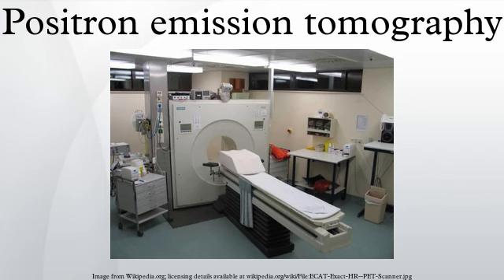As a result, FDG-PET can be used for diagnosis, staging, and monitoring treatment of cancers, particularly in Hodgkin's lymphoma, non-Hodgkin lymphoma, and lung cancer. Many other types of solid tumors will be found to be very highly labeled on a case-by-case basis, a fact that becomes especially useful in searching for tumor metastasis, or for recurrence after a known highly active primary tumor is removed.